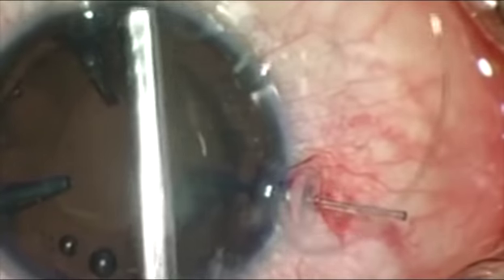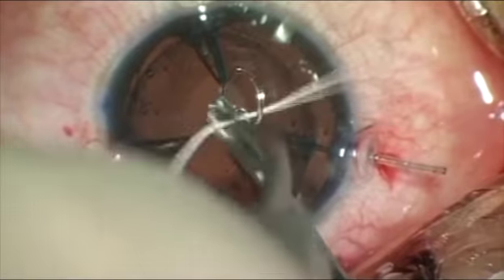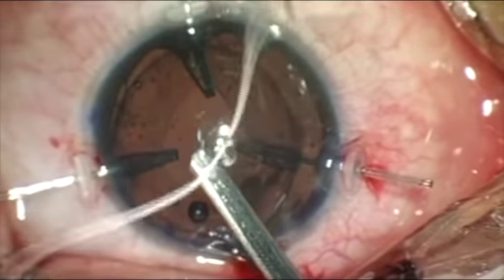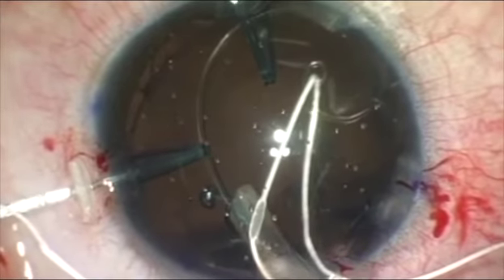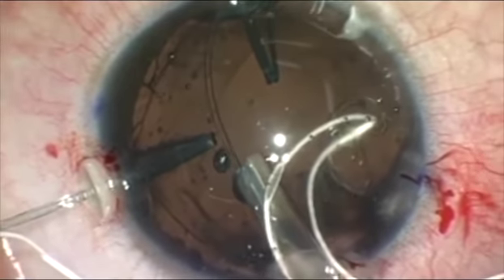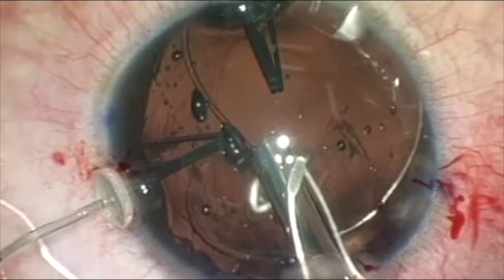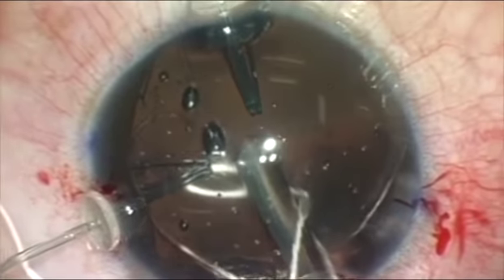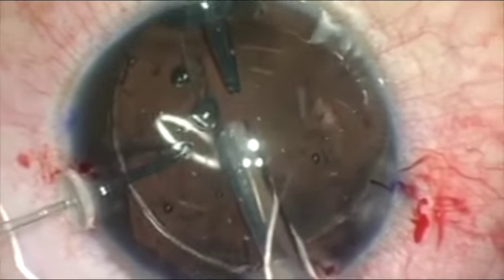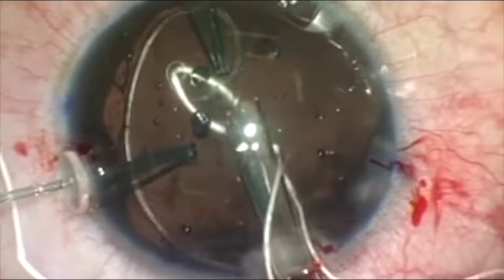CTR is now retracted to stabilize it, and we will be using Gore-Tex suture, which is fixated to the eyelet of the device. In the process of injection, you see that the bag is still supported by 2 capsular hooks, and we are gently inserting CTR inside the capsular bag.